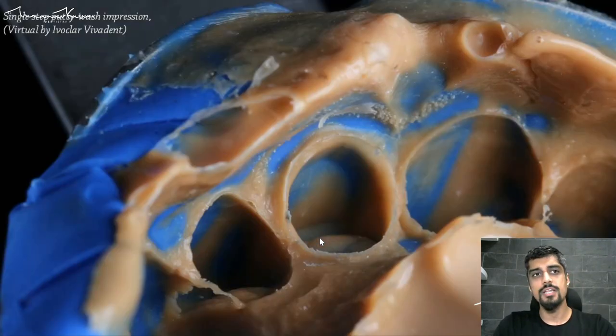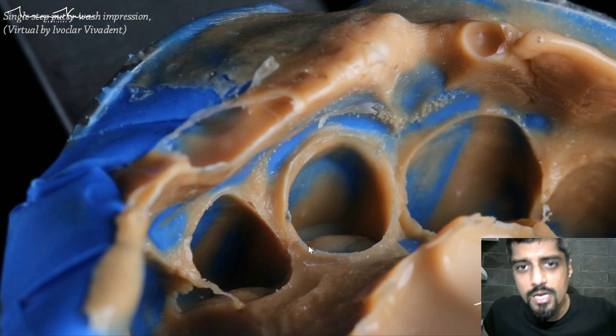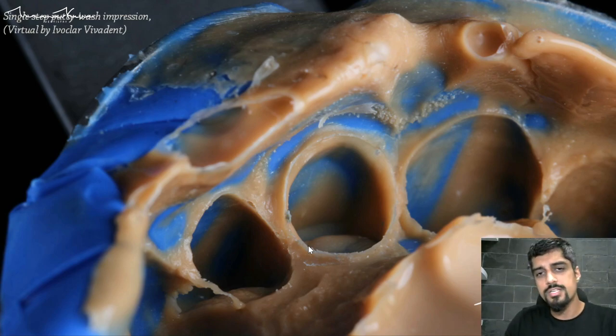This is the impression that you get — a single step putty-wash impression. How do you read an impression? How do you know it's a good impression? When you can see the rough outer surface, which represents the unprepared tooth structure. I've mentioned this in detail in the impressions lecture — please go and check it out.